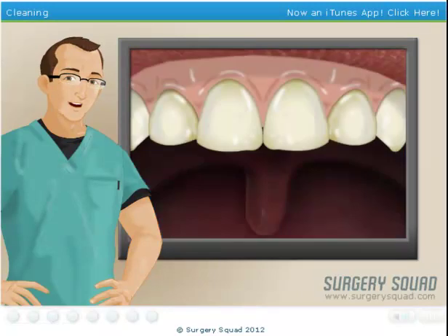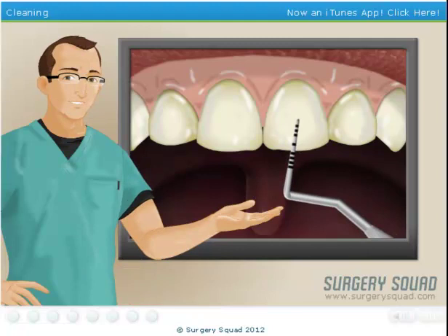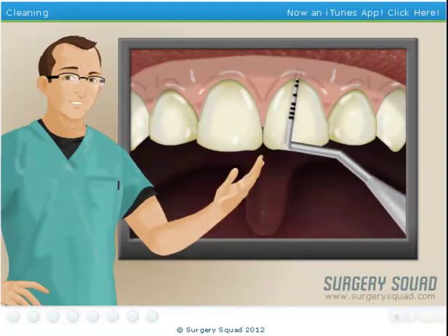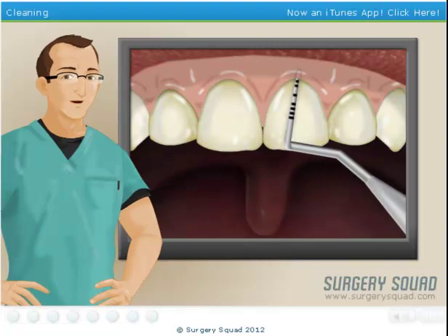You'll need to measure the depth of the periodontal pockets around each tooth using a periodontal probe. The probe is inserted with light pressure between the tooth and gum. When the probe is inserted, it will result in obscuring a section of the periodontal probe's tip. The first marking visible above the pocket indicates the measurement of the pocket depth.